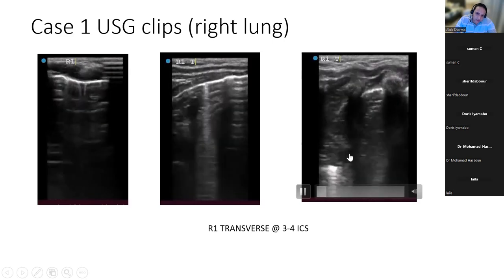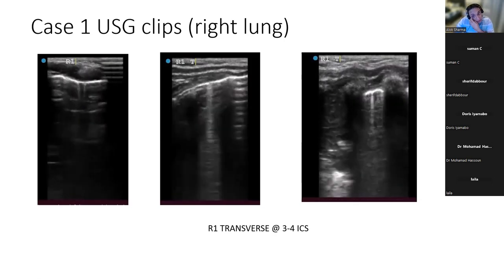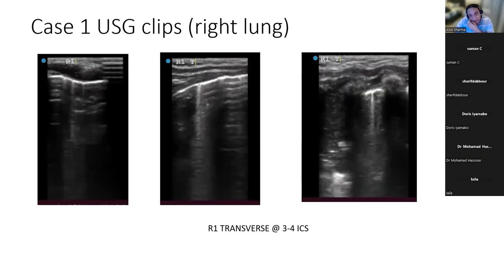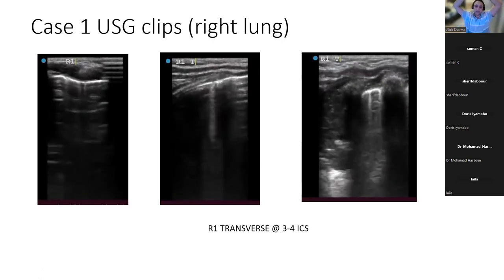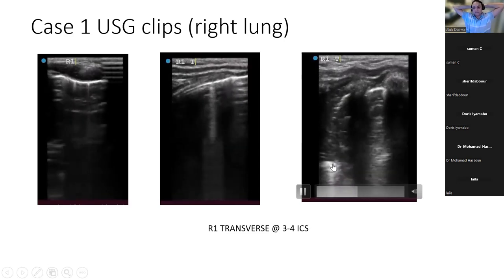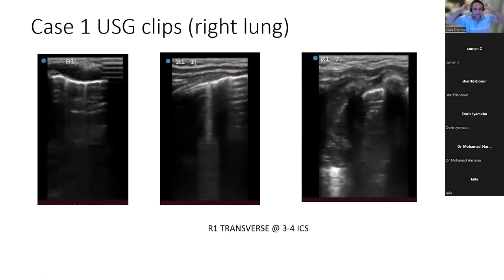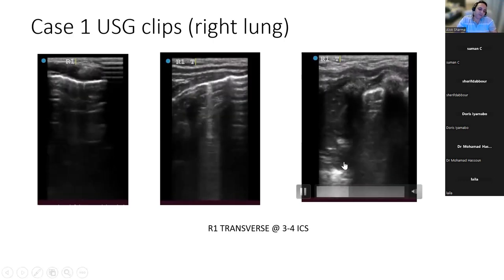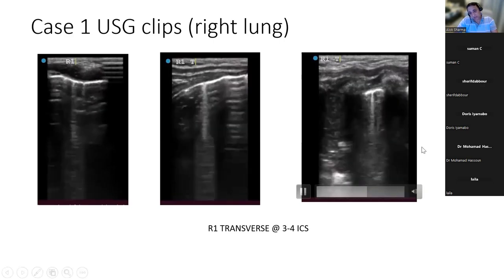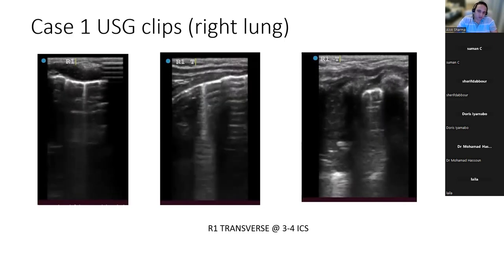This one? So again, this could be consolidation at the margin of the thymus. And you've got an acoustic shadow coming from the rib, but there's just a blood vessel coming at the bottom. Now that could be atelectasis, or that just could be thymus. I think there's definitely no shred sign there, but you've lost your pleura at the top. For me, I just wonder whether you've got a right upper lobe collapse consolidation, and that is either thymus coming into contact with the consolidation, because you've lost your pleural line.